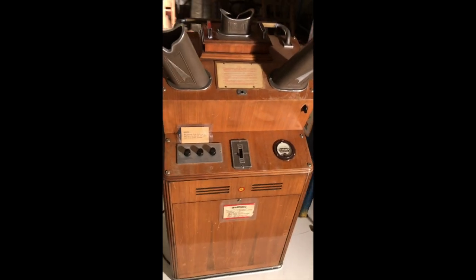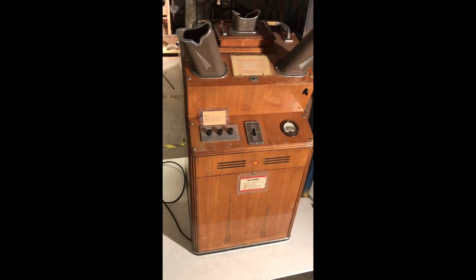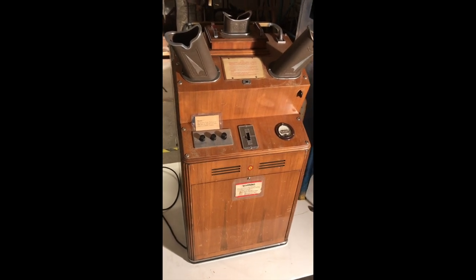But what is a shoe fitting fluoroscope? How was it used? Where was it used? And why was it dangerous?